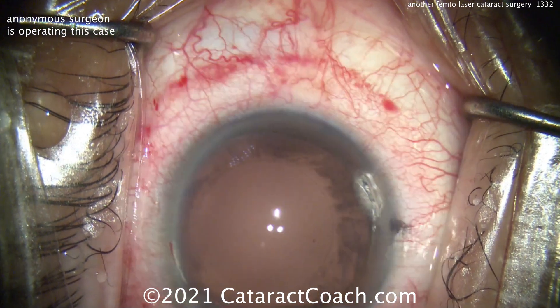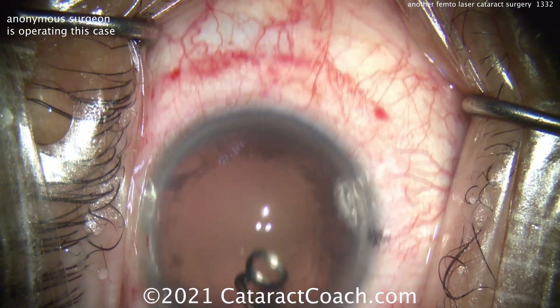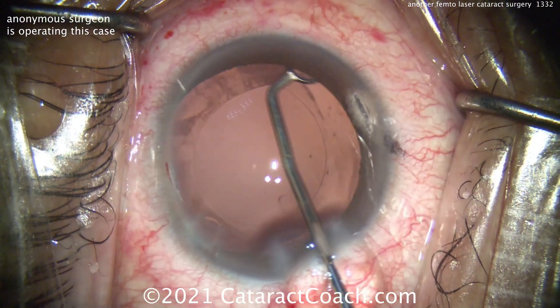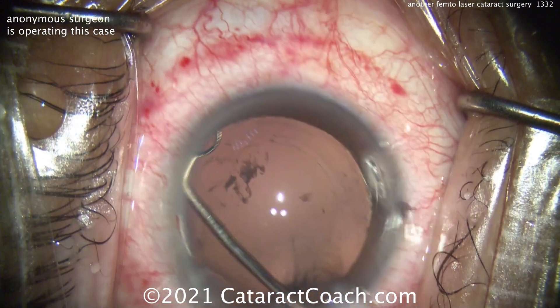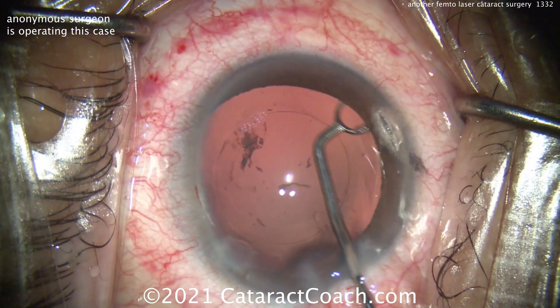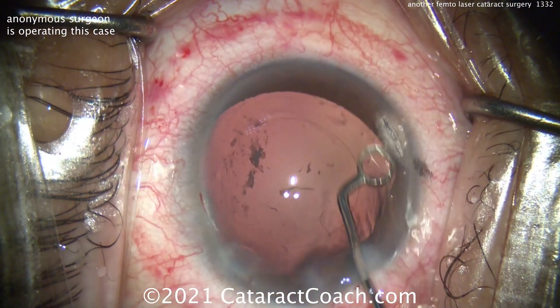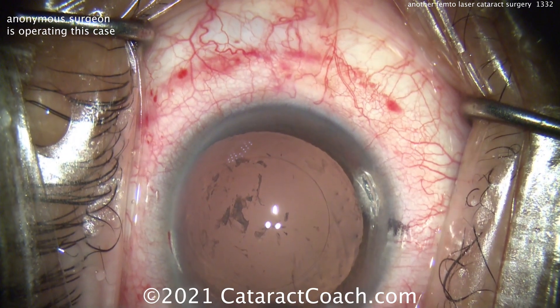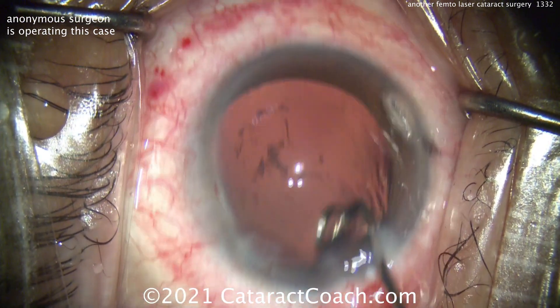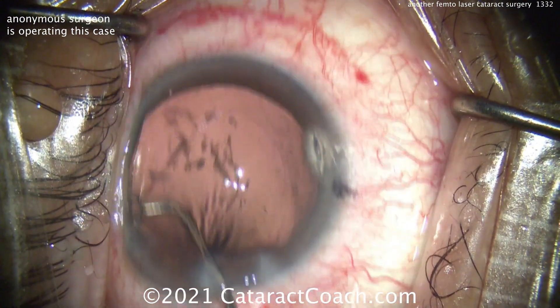Looks like we're going to do a capsule polishing. Yeah, I like that. These little ring devices are capsule polishers — you can flip them over and use both sides. Basically, the edge of that ring has a little bit of a sharper edge, not knife-sharp, but enough of a rigid edge that you can go along and scrape or polish the undersurface of the anterior capsule. That looks really nice, and you can see you get all that lens epithelial cell material removed.